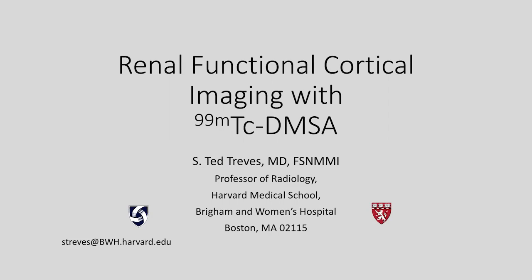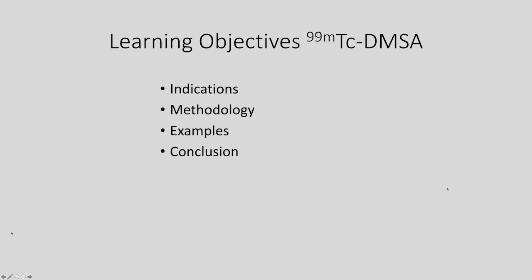Imaging of the kidneys with DMSA provides a real functional display of the kidneys. It's not an anatomic image, it's an image of the uptake in the tubular cells of the kidneys. The learning objectives of this talk include indications for the test, methodology, some examples, and conclusion.